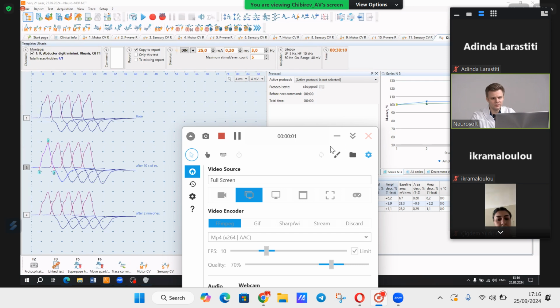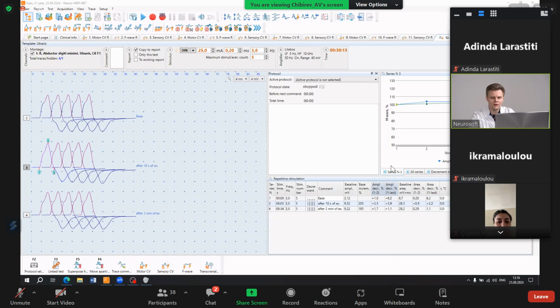Regarding 19 millimeters of distance, it's recommended that the distance is more than 10 centimeters, or 100 millimeters, between different points of stimulation. No matter which nerve or which muscle, it is best to have a distance of more than 100 millimeters. But it's not possible to have this distance every time because of short limbs.